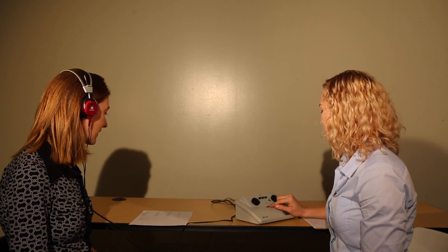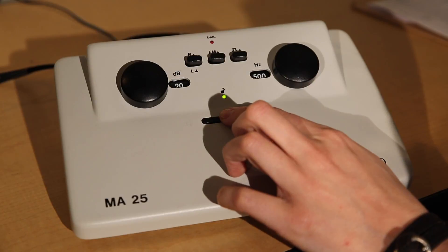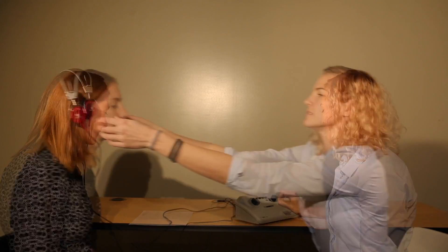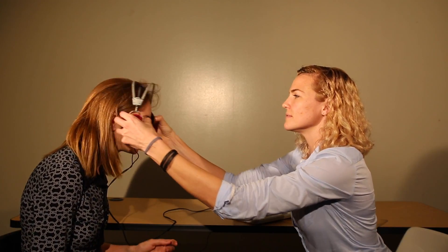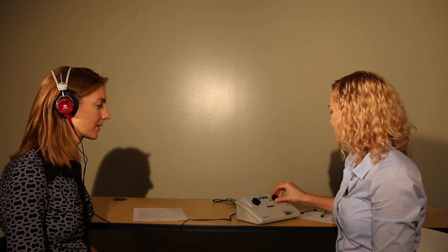If the patient does not respond at 4000 hertz in the right ear, switch to the left ear. If the patient responds, continue screening in the left ear at the other three frequencies. If the patient is not responding at 4000 hertz in either ear, the patient may not understand the instructions, or they may have hearing loss. Repeat conditioning with headphones off at 90 decibels or headphones on at 50 decibels, and then begin the screening again. If there is still no response, reschedule or refer the patient.